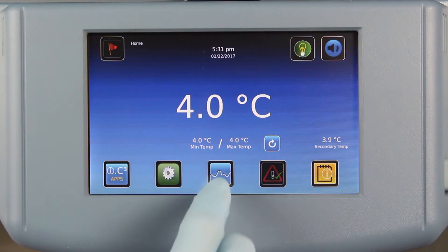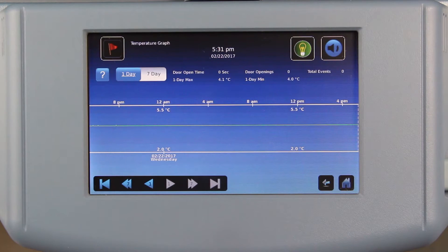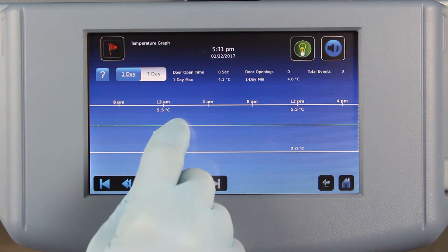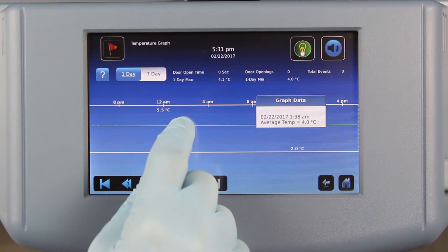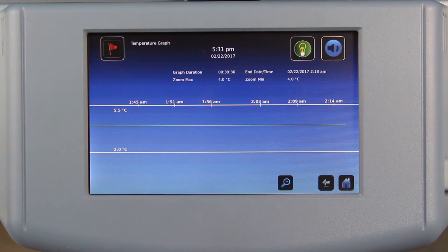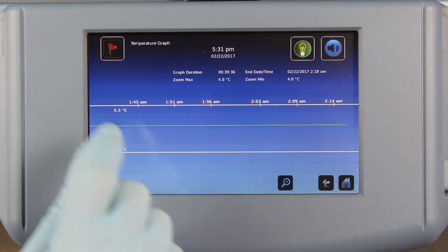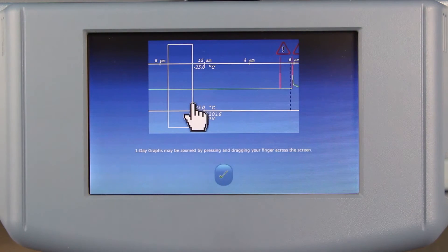Next, we'll look at the new features of the Interactive Temperature graph. There is now a one-touch feature to see the actual temperature measured at a point on the graph. This enables users to touch the graph and bring up point-in-time detail. We've also added a zoom feature to get a close-up view of a particular time period.